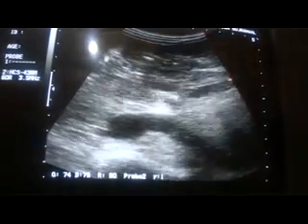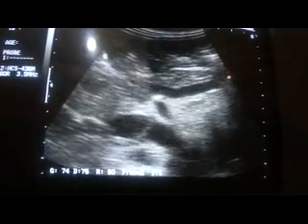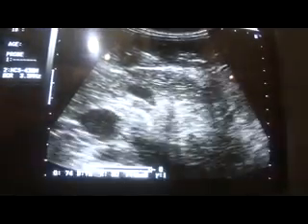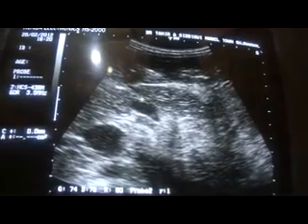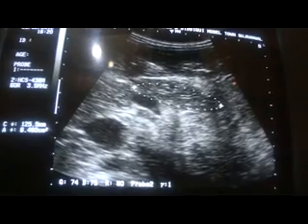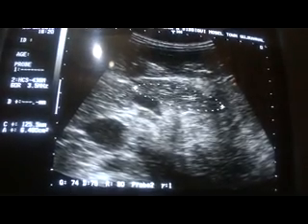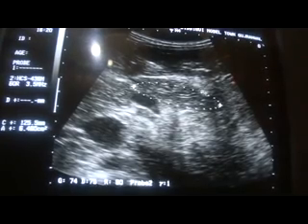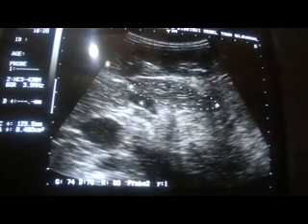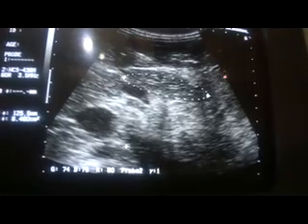Again, I have requested the patient to take a deep breath and hold it so that you can see the pancreatic tissue. Now this is the pancreas, and you can see a duct. This is the pancreatic duct. So the pancreas is normal at least at the region of its body. This is its superior mesenteric vein, and the mass is occupying the rest of the abdomen.